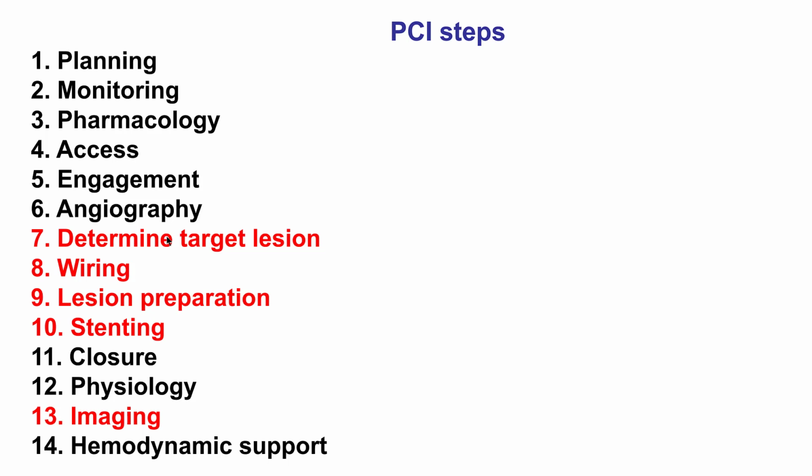He did have significant angina, so coronary revascularization was required. He was seen by the cardiac surgeons, and it was determined that he would not be a good candidate for bypass surgery given age and comorbidities, and therefore was referred for percutaneous coronary intervention. We do have multiple lesions in the LAD, the right coronary CTO, and in a small circumflex. The decision was to attempt PCI of the LAD, that was the larger vessel.